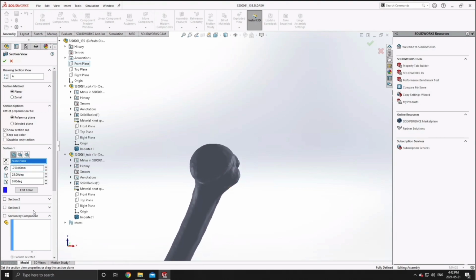So in order to do this analytically, essentially I'm finding the crest of the humeral head, or I guess the most proximal aspect of the humeral head here, and I'm moving my cut plane distally by, in this case, 50 millimeters, in order to find my first centroid that I'll be using in order to calculate that central axis, or the central long axis of the humerus.